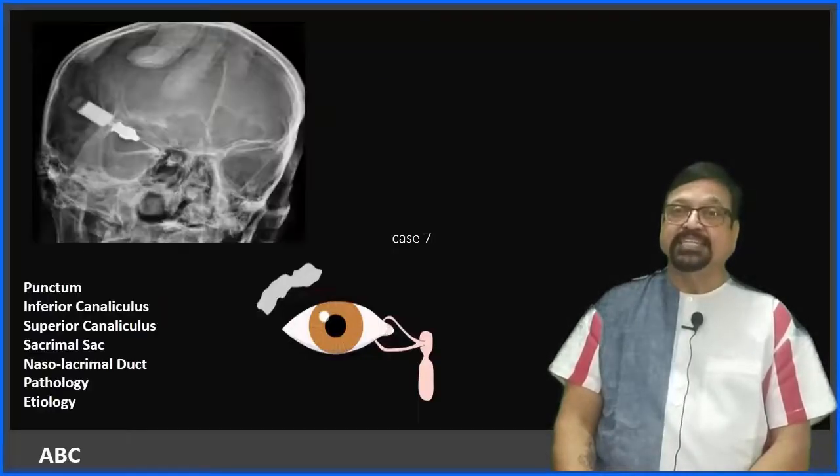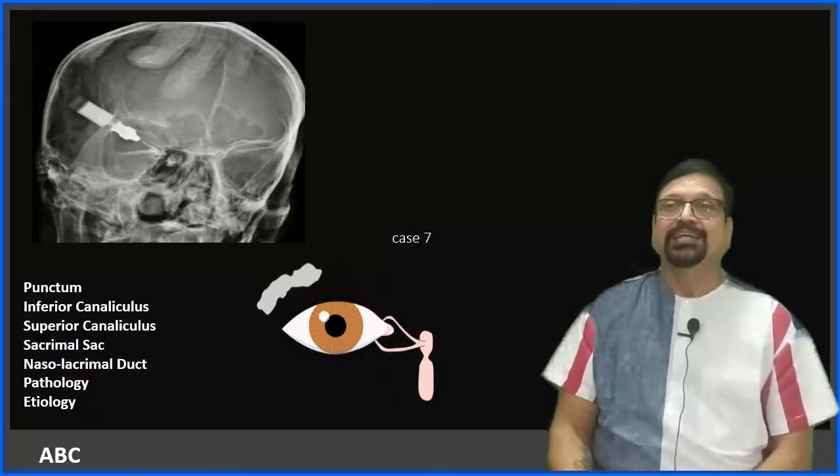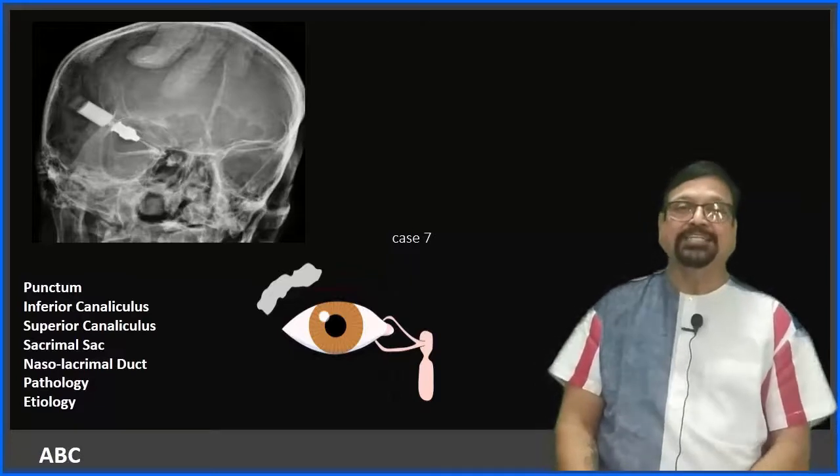When you are seeing it, see also the sac. Whether the sac is showing any filling defect is equally important. Though we drain them at the beginning of the procedure, if they are still seen, then you will have to go for the interpretation stating so.